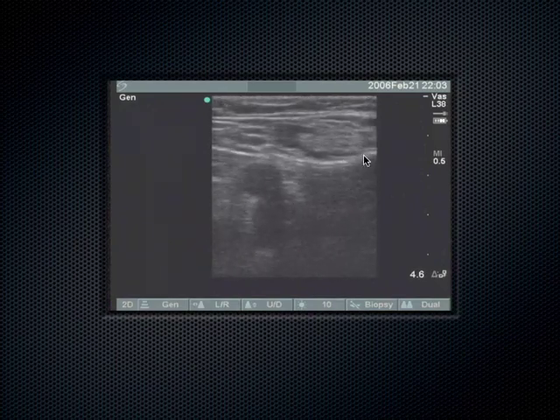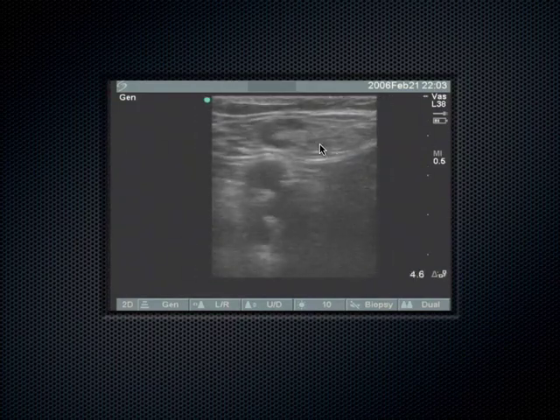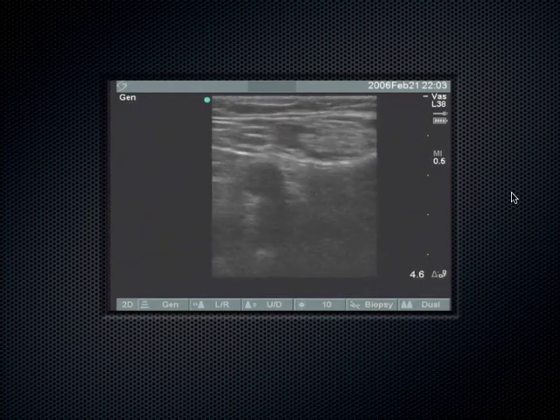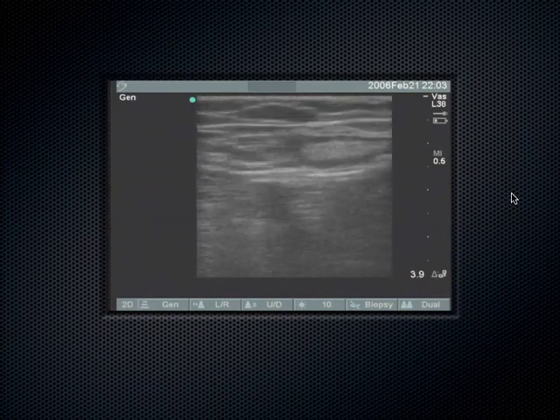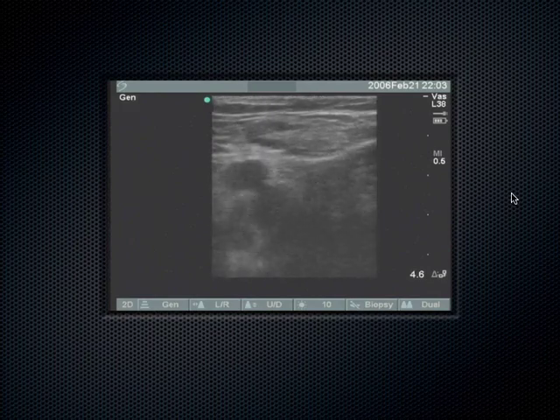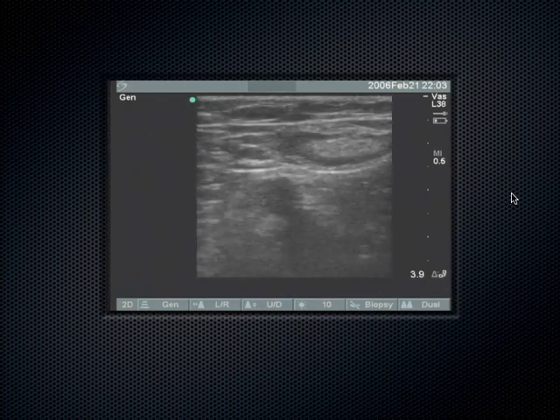Right leg, because this is the femoral artery here, and there's the femoral vein compressing down there. What the heck is that up here? That's what was drawing my eye. And the first time I saw that thing, I didn't know what to make of it. I thought the patient had DVT. But you know what? These patients come in, many times we're struggling clinically between, you know, they've got this red kind of swollen leg, and you're like, is there an infection here? Is this cellulitis? Or is there a blood clot here? And so this is one way to kind of help differentiate that.